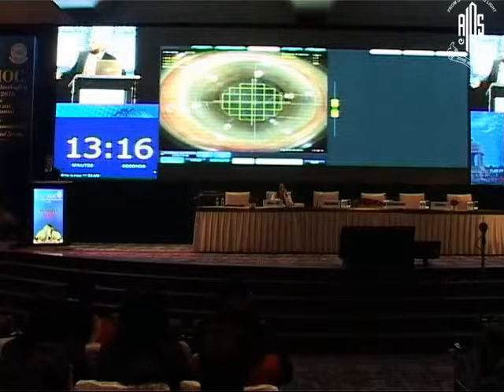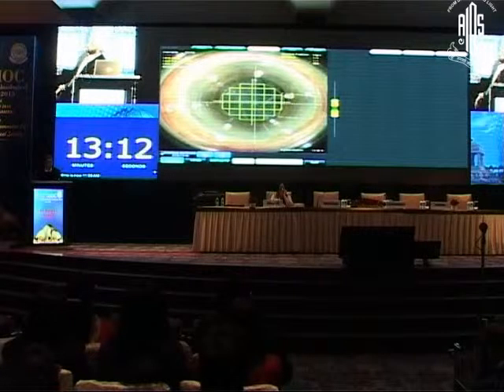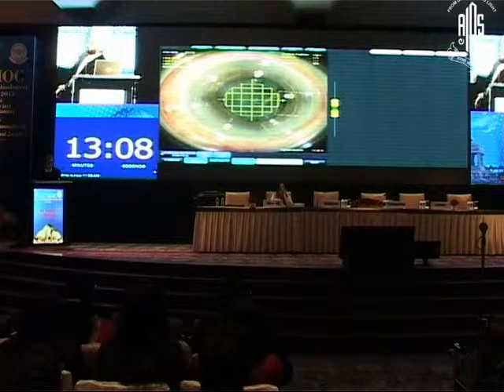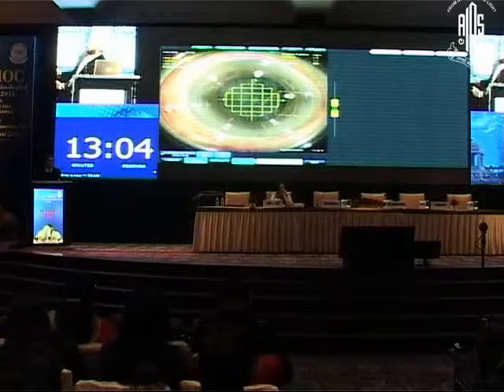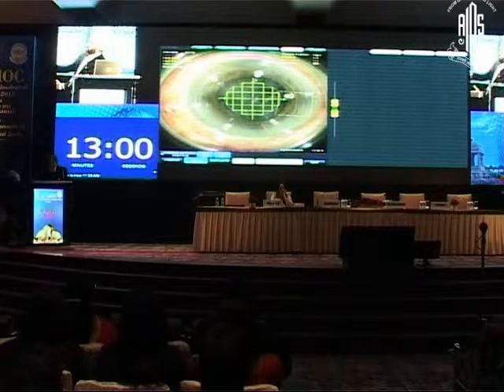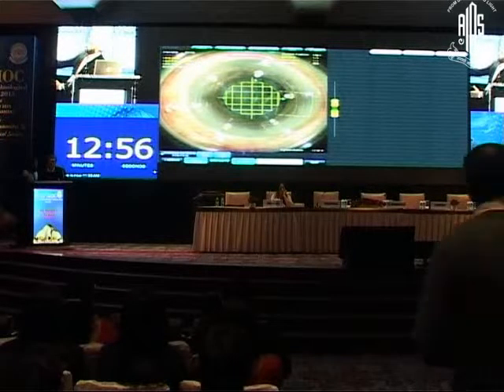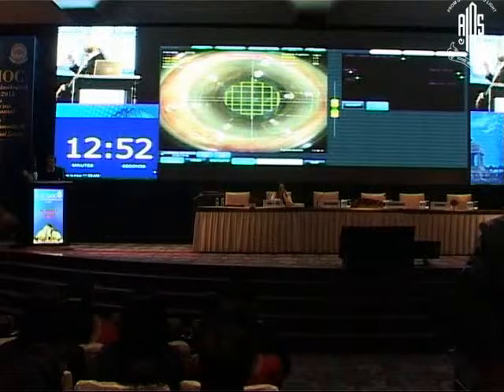And once I have docked the eye, you can see that the iris is not pretty good, it's small. I am just putting the side port here. And then you can see that I have centered the capsulotomy and the nucleus fractionation. Once you have centered, you have to see that this does not touch the iris. So you have to have a clear zone, or you could reduce the fractionation area. So I thought things would be good.